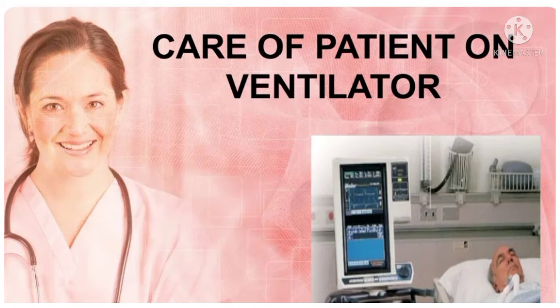Continuous positive pressure ventilation (PPV) increases the production of secretions regardless of the patient's underlying conditions. The nurse should assess for the presence of secretions by lung auscultation every 2 to 4 hours. Perform measures to clear the airway of secretions by doing suctioning, chest physiotherapy, frequent position changes, and increased mobility as soon as possible. Maintain humidification of the airway through the ventilator to liquefy secretions so that they are easily removed. Monitor vital signs as directed.